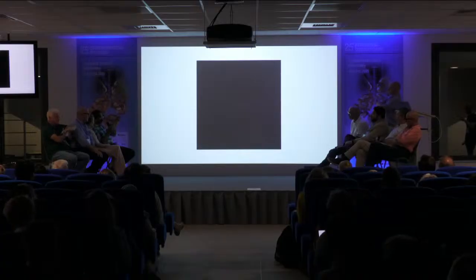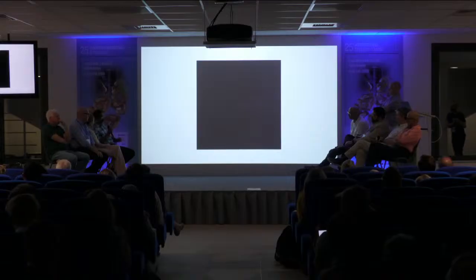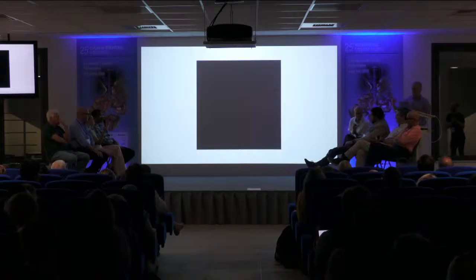So you have to make a groove at the inferior part of the incus so that it sits onto that groove, yeah. And then the upper part is like a pyramid. Yeah, okay. So this is really interesting to know what you do when you haven't got access to any prostheses or all the fancy stuff.